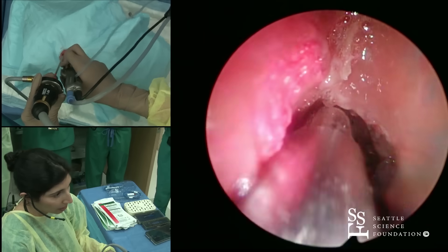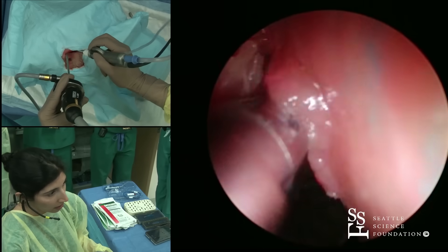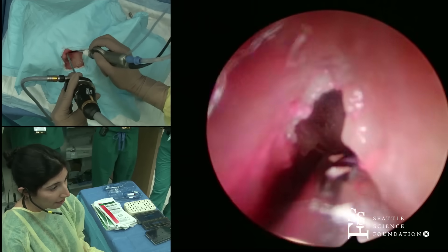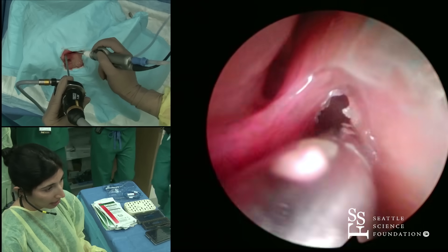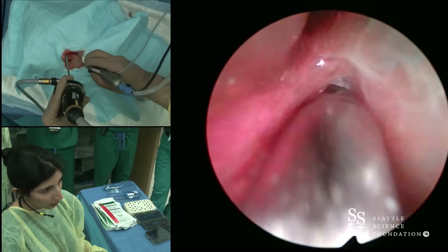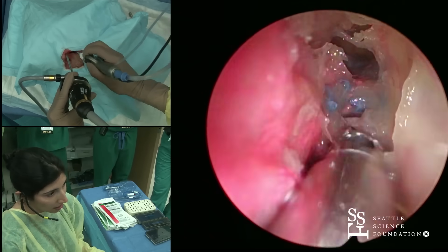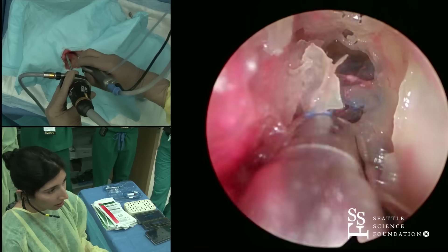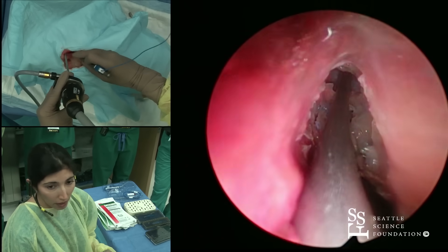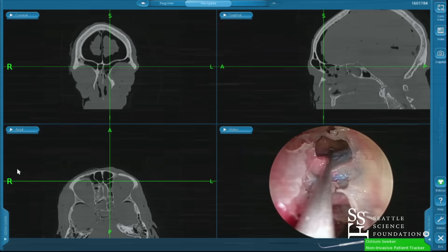You can see this blade can be turned. I'm just going to turn it to take all the stuff that I've just brought towards myself here. You can see here at the axilla of the middle turbinate — this is often a place where I'll make sure that I've taken away all of this remnant uncinate that's lateral here, because sometimes it can really sit down in your view. We're just taking down the rest of these septations. Now you can see we're in that frontal sinus.